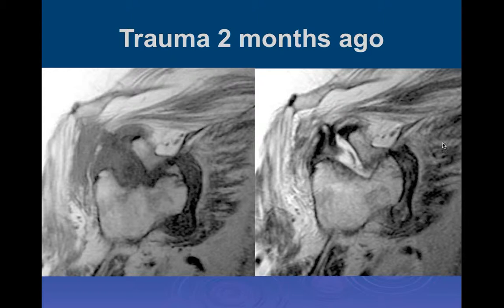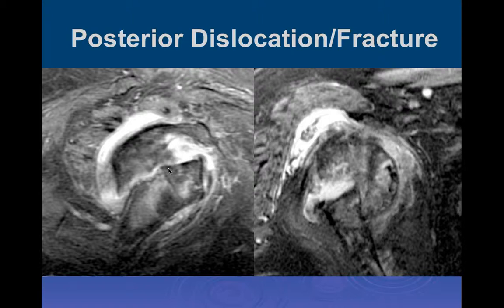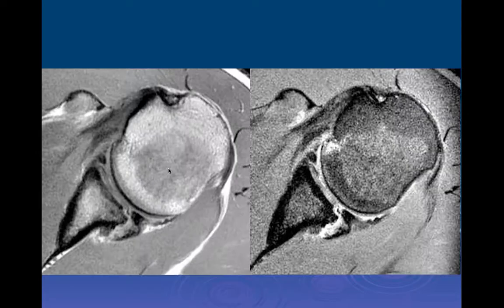Okay, this is one of the more abnormal ones that we've seen. Oh my God. So there is a V-shaped divot in the humeral head. And when you look at the glenoid, I think it's underdeveloped, or at least on that one, it kind of looks underdeveloped. Oh, one cut. Okay. And then there's a lot of soft tissue density between the glenoid and the humeral head. So I'm not sure if that's a ligament that has been torn into there, or if it's just a lot of, yeah, severe diffuse fatty atrophy of the muscles.